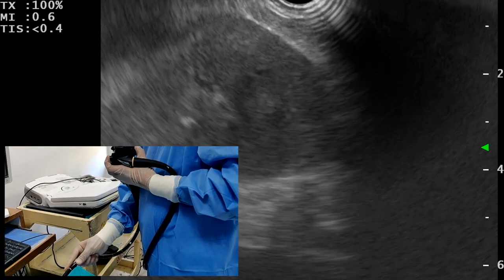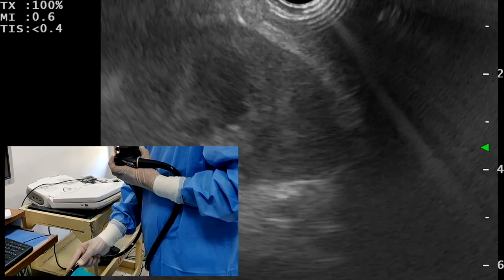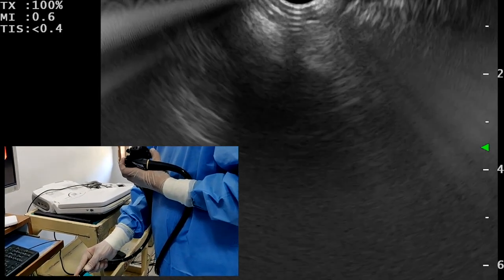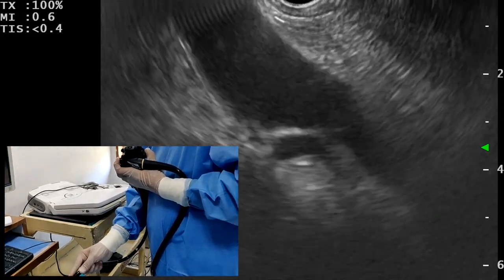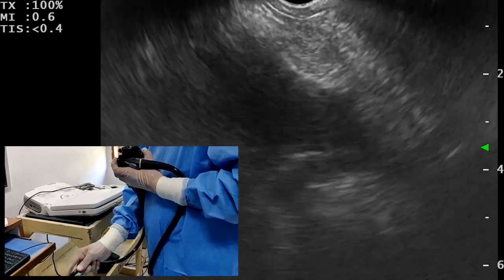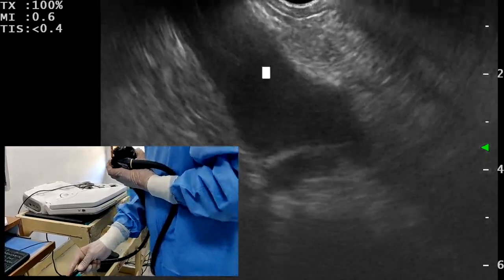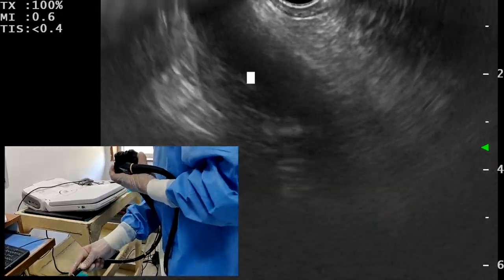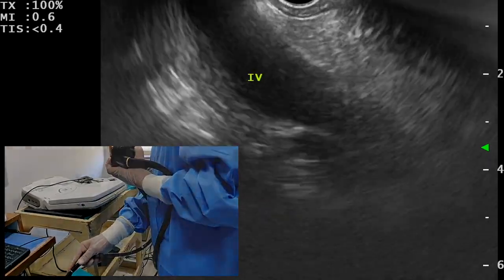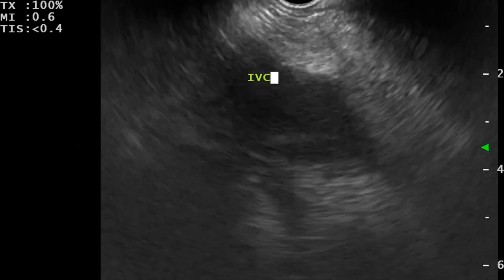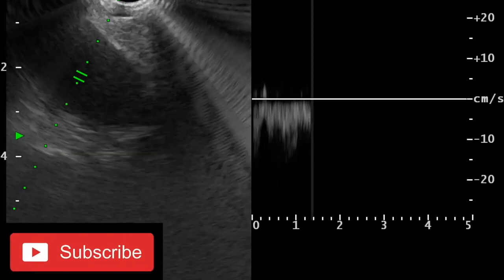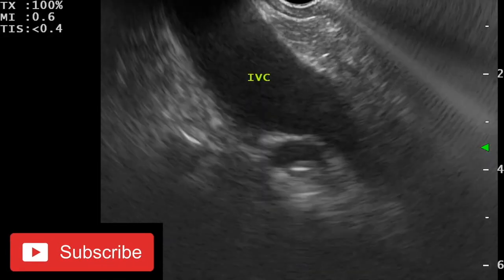Our scope should be very stable. With anti-clockwise torque we can see the right kidney. Once we see the right kidney, with a subtle clockwise torque we can see a large vessel which is the inferior vena cava. The vessel is running from left up to right down, with our cranial side on the right side. If we apply Doppler we can see the venous blood flow — this is the inferior vena cava.